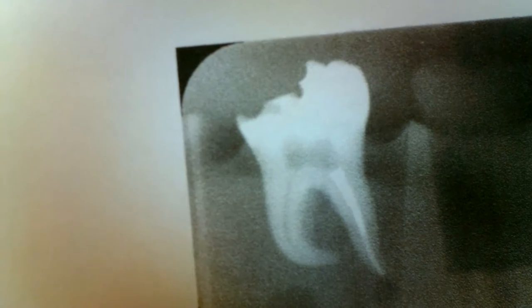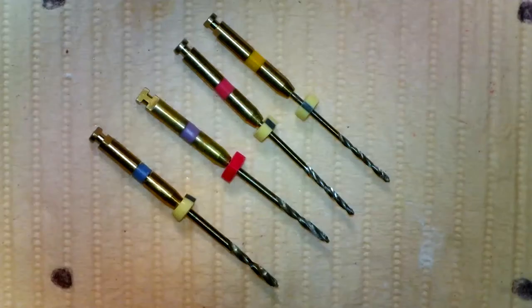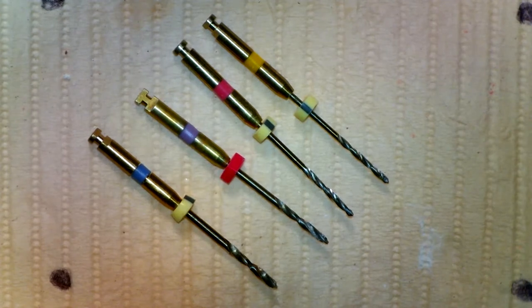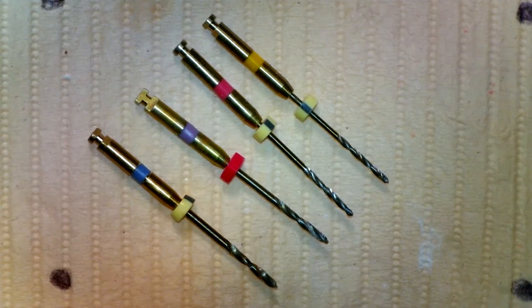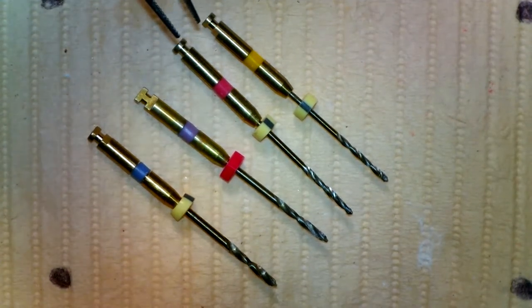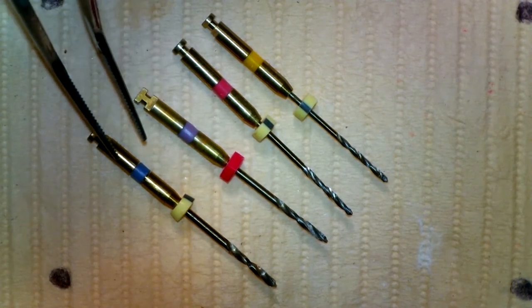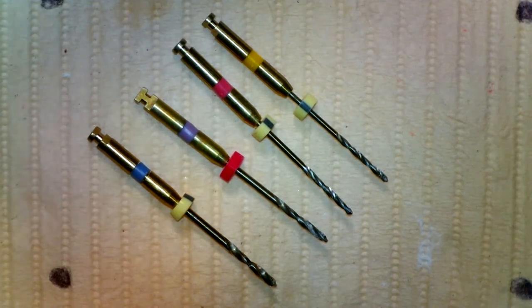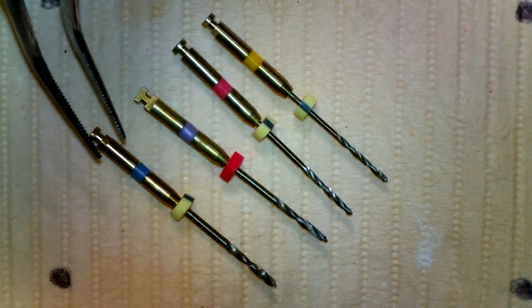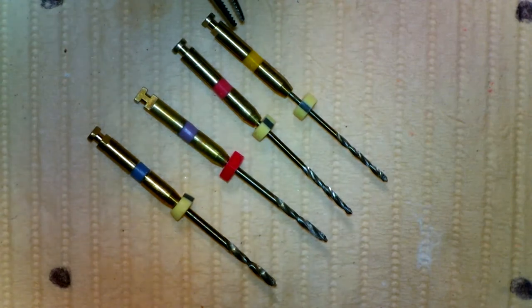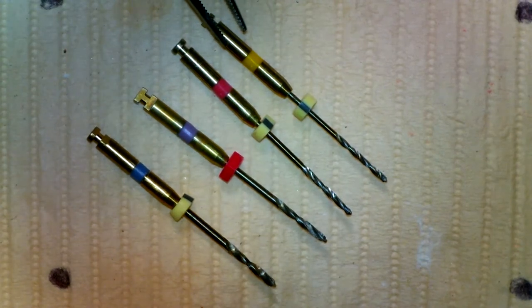We will size it up just like we did the anterior. We're getting ready to clean out the gutta percha. We have different sizes of posts: 3, 4, 4½, and 5. There is no 3½ post. We always start with the smallest post.